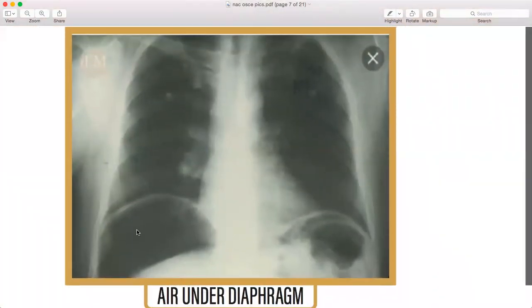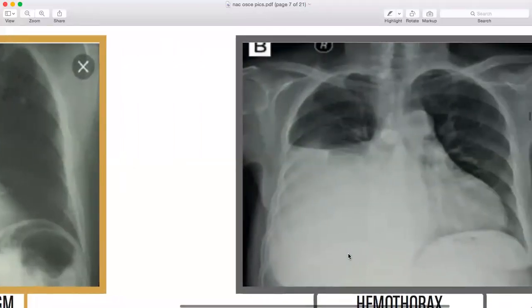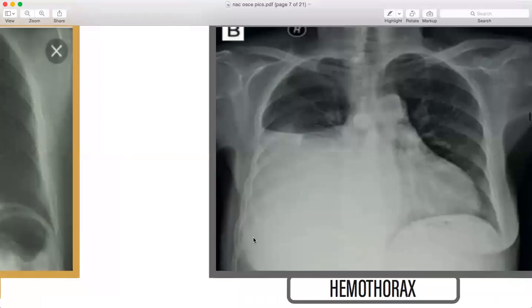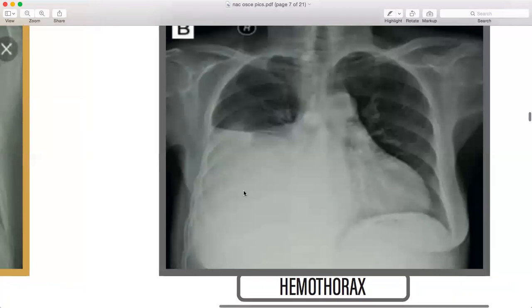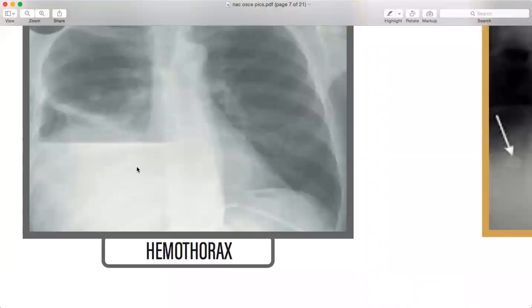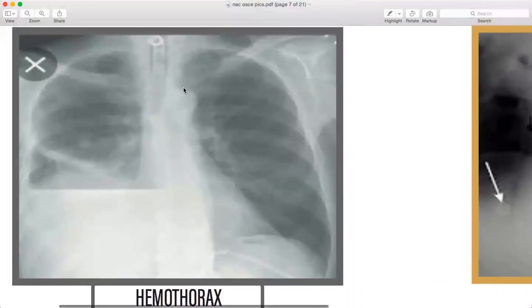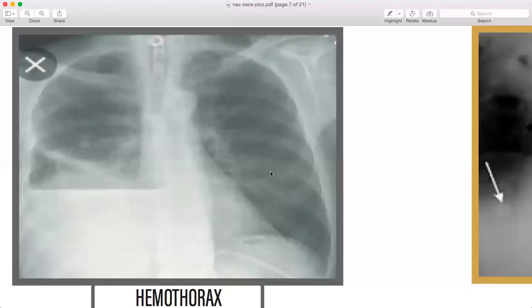Air under the diaphragm indicating perforation. Then hemothorax — this is how hemothorax looks on X-ray. You can see the trachea is midline and this is the aortic knob. This is the chest X-ray — a little bit of hint on how it will appear and present.